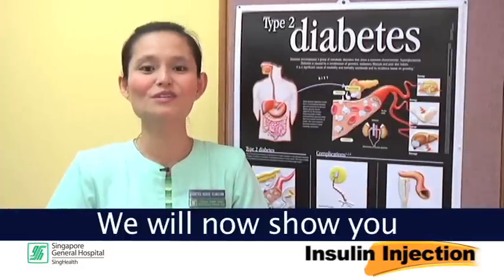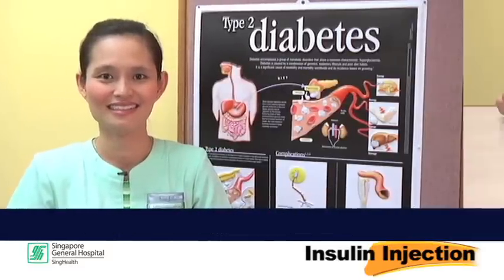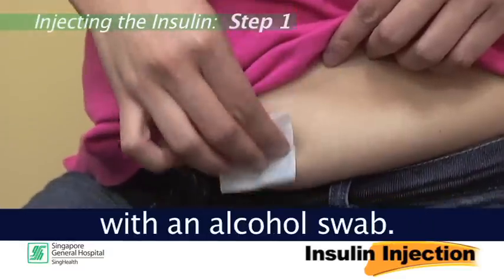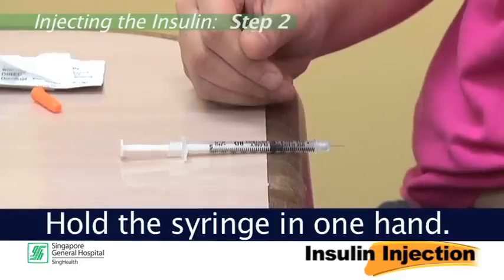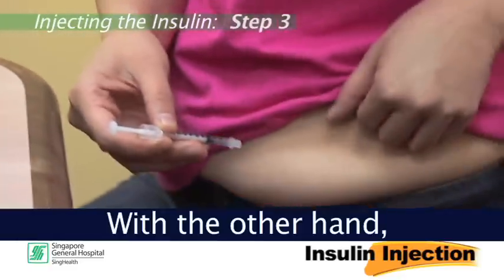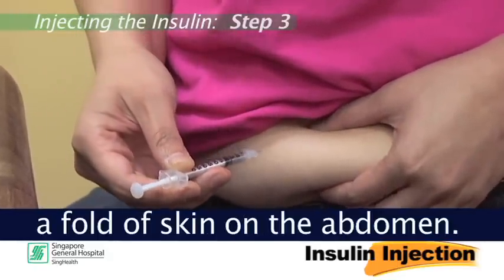We will now show you how to inject the insulin. Step 1: Clean the injection site with an alcohol swab. Step 2: Hold the syringe in one hand. Step 3: With the other hand, gently pinch up a fold of skin on the abdomen.